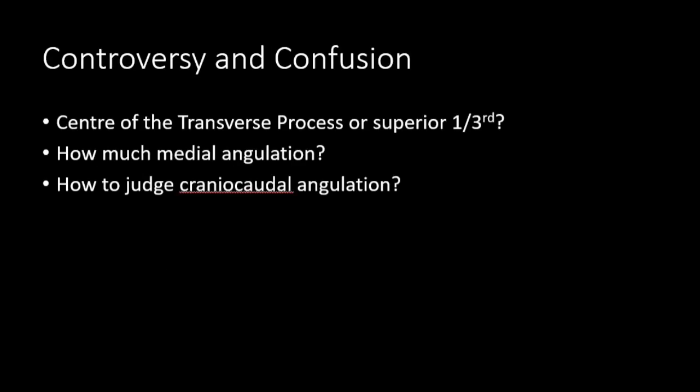There is some controversy and confusion regarding thoracic pedicle screw fixation, simply because there are multiple methods described in the literature. Where is the entry point? How much medial angulation? How much craniocaudal angulation? There are multiple papers which describe different varieties of these, and they recommend different medial-lateral or craniocaudal angulations, making the confusion more. Most orthopedic and neuro spine surgeons prefer to have their own method of putting in pedicle screw fixation. So this video is basically for that.